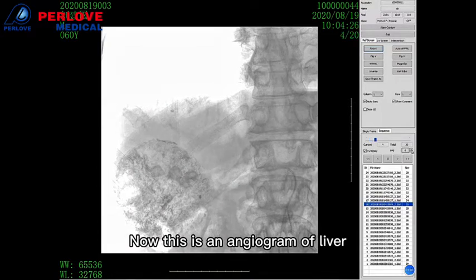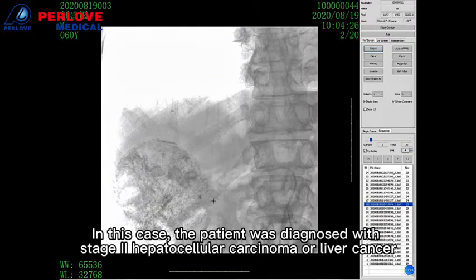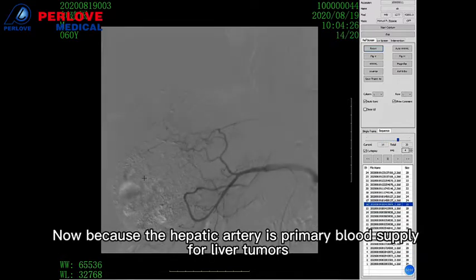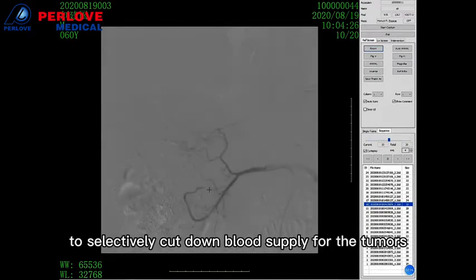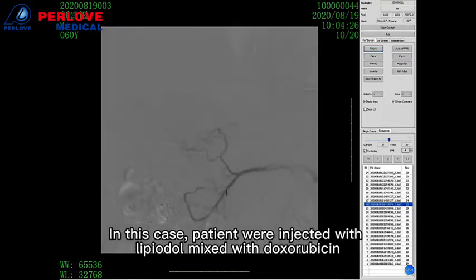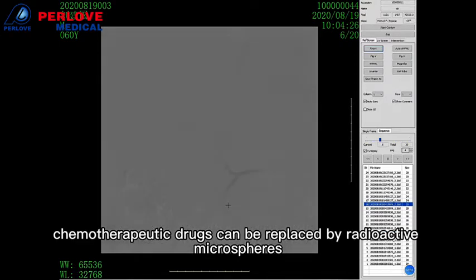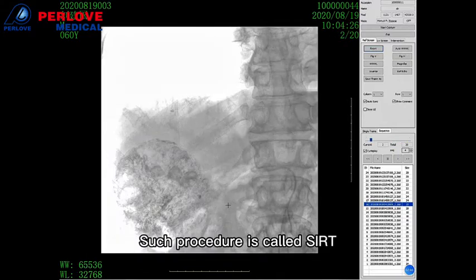This is an angiogram of the liver. One established interventional procedure for cancer treatment is transcatheter embolization. In this case, the patient was diagnosed with stage 2 hepatocellular carcinoma, or liver cancer. The tumors are susceptible due to metastasis. Therefore, a minimally invasive embolization therapy called TACE — transarterial chemoembolization — can be performed. Because the hepatic artery is the primary blood supply for liver tumors, the goal is to deliver chemotherapeutic drugs or embolization material to selectively cut off the blood supply, slowing and eventually killing the tumor. The patient is injected with lipiodol mixed with doxorubicin, common embolization materials for cancer treatment. In some cases, chemotherapeutic drugs can be replaced by radioactive microspheres like Y-90 microspheres to selectively irradiate the tumors while leaving healthy tissue relatively unaffected — such a procedure is called SIRT, Selective Internal Radiation Therapy.